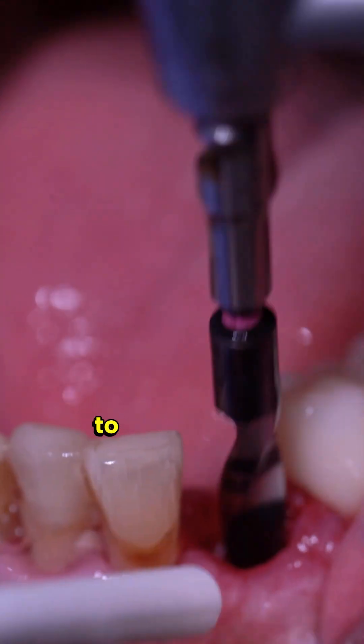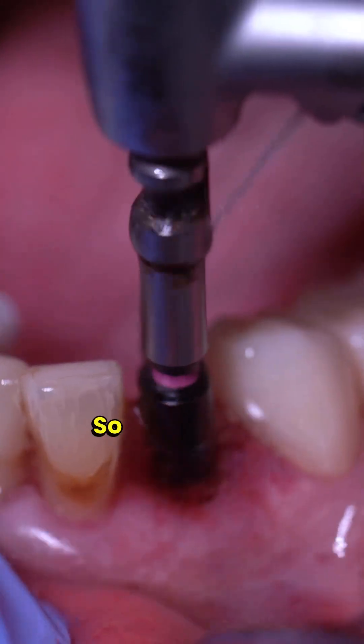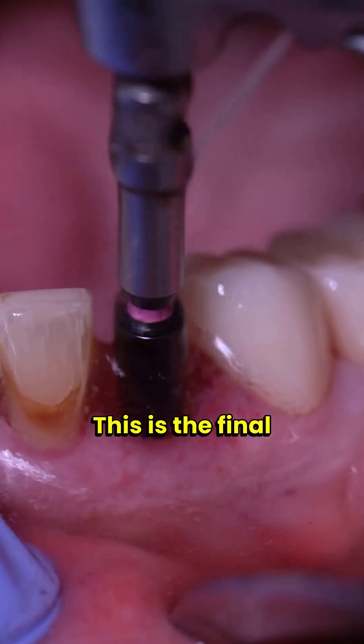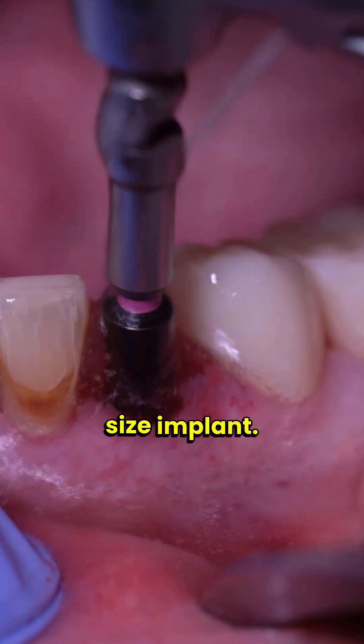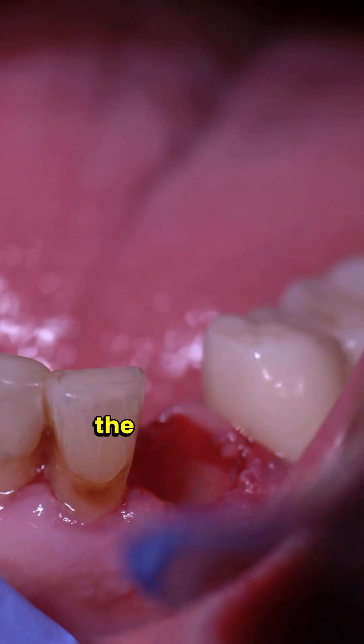I tried to use the pink drill but it came dislodged from the extender — I put it back on and now we're ready to go. This is the final drill in the drilling protocol for this implant size, and now we are ready to place the implant.